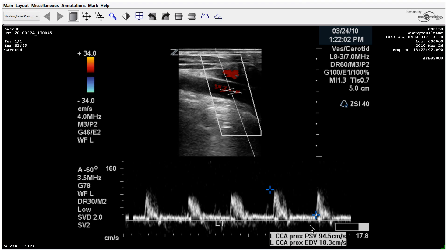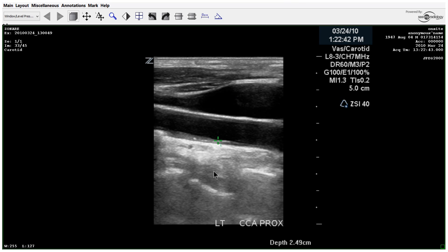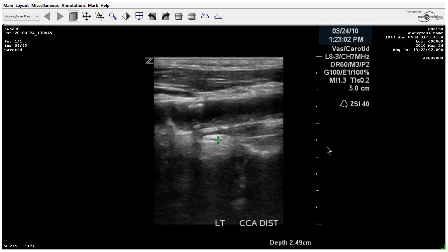Moving back to the proximal, you can see some intimal thickening and some calcification. Now moving to the distal — this definitely does not look like a clean vessel. There are focal calcifications, you can see the posterior shadowing, and just irregular heterogeneous plaque.